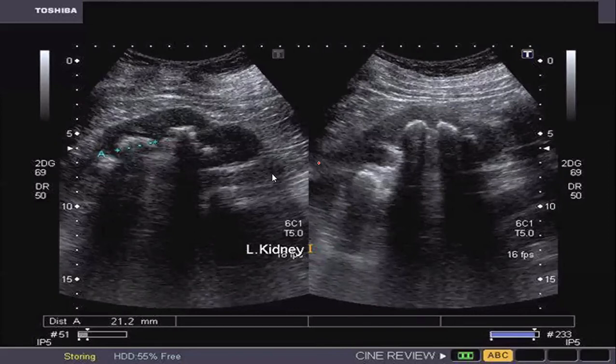But it's important now for you, Med 1, Med 4, and the interns, to try to look at the lesion with familiarity so that you will learn from it, and later on, we will justify what made it that way, in some next sessions. What is important is this is a shadowing. The shadowing obscures these portions here.